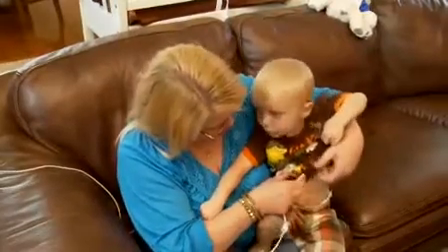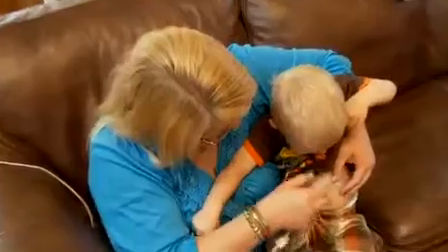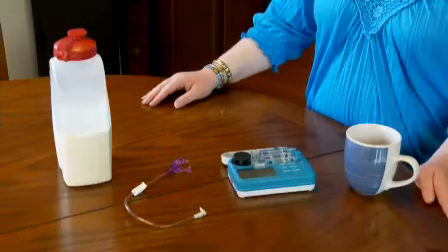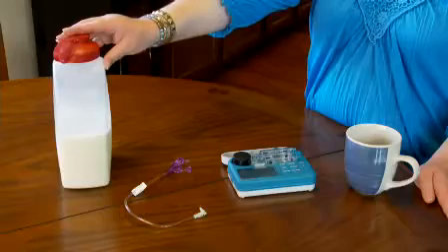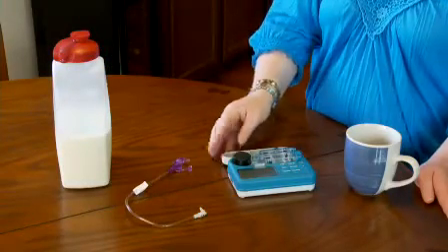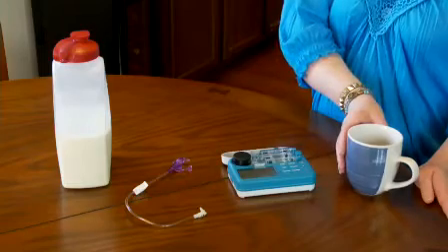Before administering food or medication, the patient should be in a slightly elevated position and stay upright for at least 30 minutes after feeding. Gather all the needed materials and put them in one location for easy access: formula, feed set, catheter tip syringe or enteral feeding pump, and water for flushing the tube.